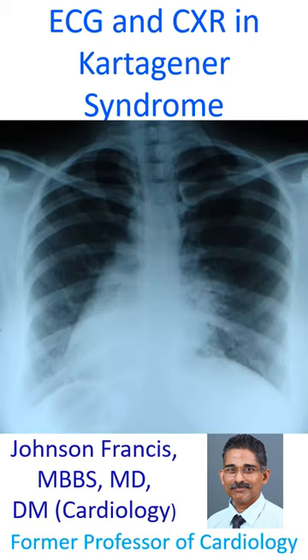X-ray chest PA view in Kartagener's syndrome showing dextracardia and features of bronchiectasis, more on the left side. The left dome of the diaphragm is higher, and the fundal gas bubble is seen on the right side, indicating situs inversus.